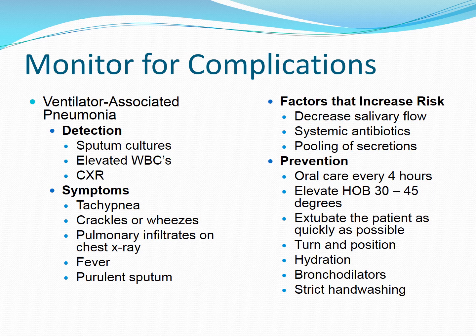The cuff on that endotracheal tube, what it does is it holds fluids above that cuff and secretions pool. And so that's what we need to be careful about, which is why sometimes you also have to do some oral suctioning on these patients. We do GI prophylaxis to prevent things such as a GI bleed, because remember, these patients are prone to stress ulcers.